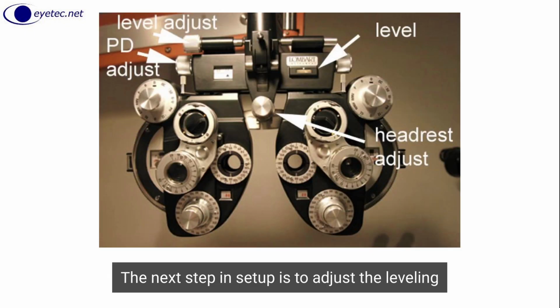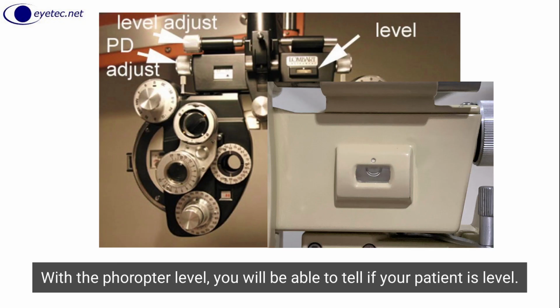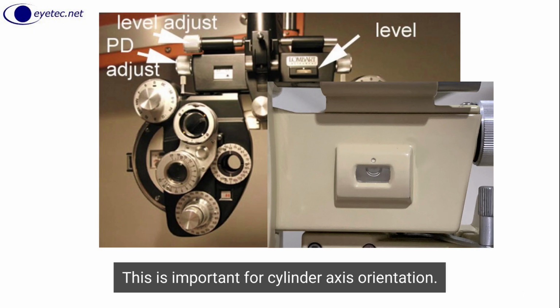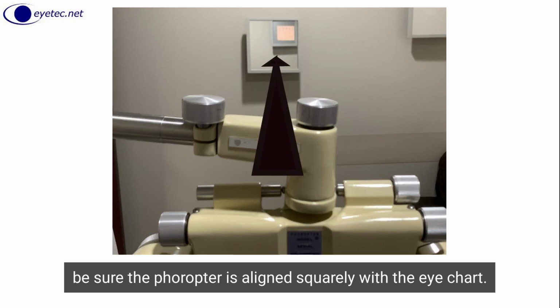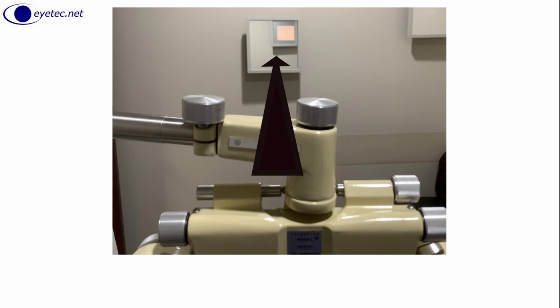The next step in setup is to adjust the leveling knob so that the bubble on the level aligns with the dot. With the phoropter level you will be able to tell if your patient is level. If not, try to get the patient to cock his head to a level position. This is important for cylinder axis orientation. The final adjustment for phoropter setup is to be sure the phoropter is aligned squarely with the eye chart. You may need to adjust the angle while positioned behind the patient.